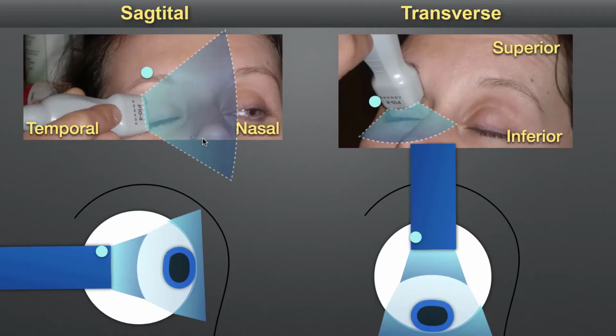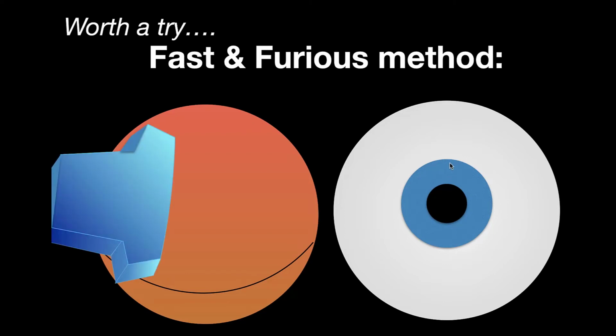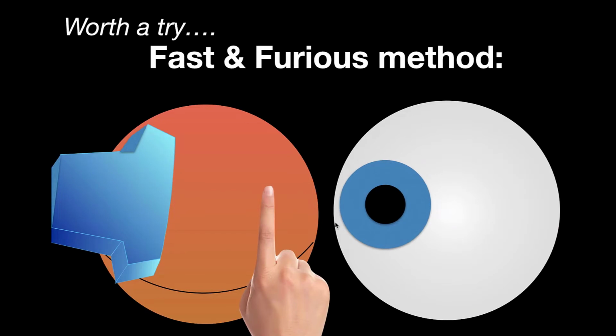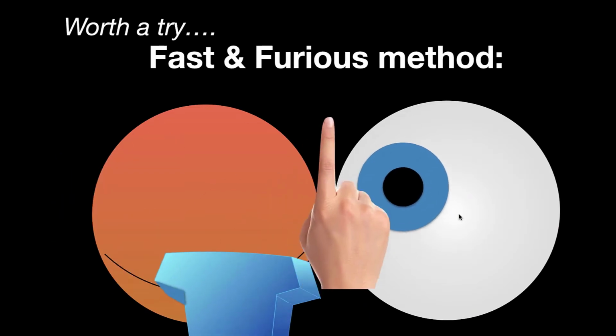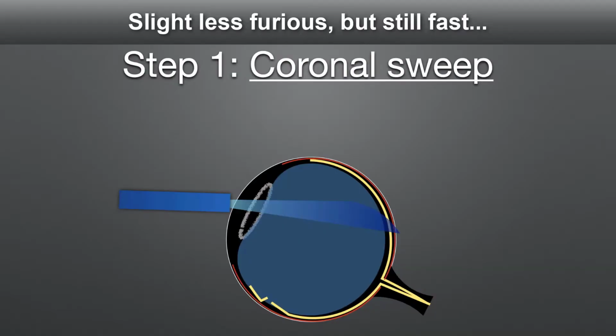So the whole point of this ultrasound is to get a good sagittal view and a good transverse view in two planes. So you want to make sure that you visualize all of the inside of the eye in these two different planes. We're going to talk about how to do that. So one thing that you can attempt to do is you can have the patient try to scan themselves. Especially if you have plastic film on one side, you can have an assistant or yourself move your finger up and down while you just hold the probe steady and watch them scan their own eyeball. Rotate the direction and do it up and down. Most patients can't follow instructions that well, so my experience has been that I usually end up scanning them anyways.